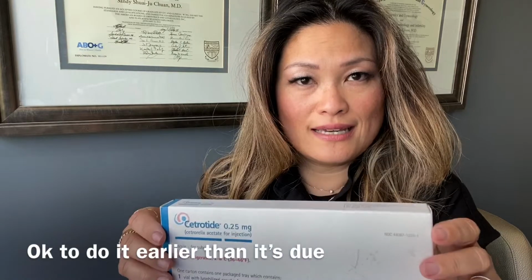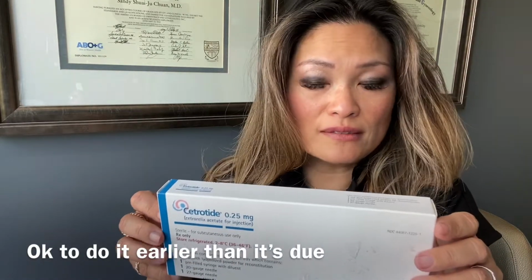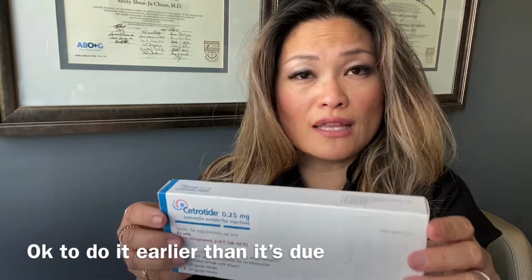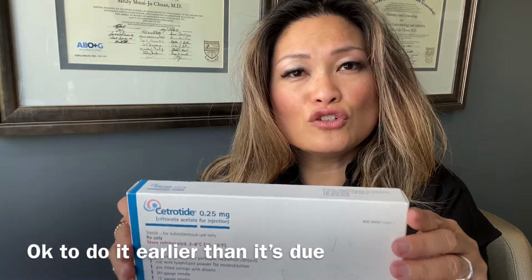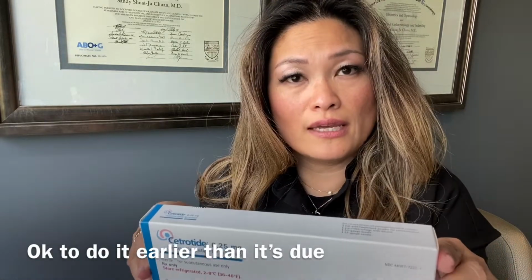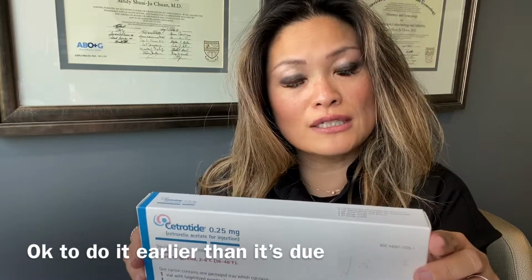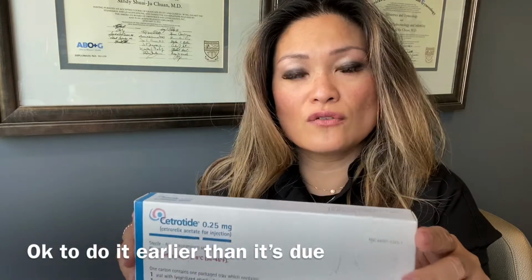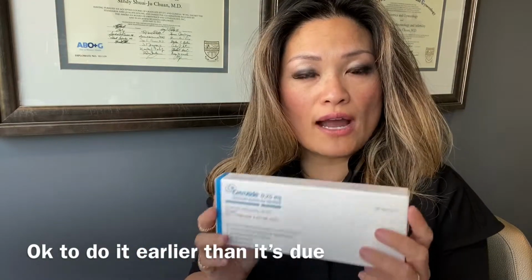On your first day, because we may be giving you the instruction to start it right after your visit, and your visit might not be till 11:30, or sometimes even noon if you're having a late appointment. And so you might do your first shot at around 11:30 or noon the first day. It's okay if you want to move that up a bit so that the next day you're doing it around 10:30, and then just staying on that schedule. So that's an adjustment for convenience, but you want to stay within that 24-hour zone as much as you can, okay? So now let's go ahead and teach you how to use this.